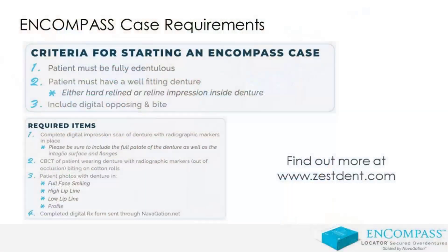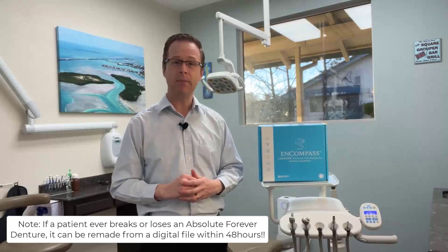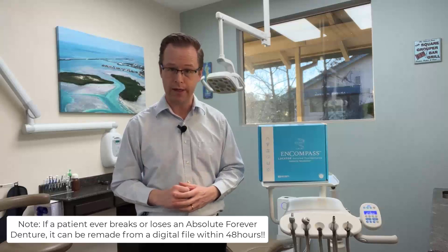Where I work up the patient with a little bit of impression, a cone beam scan, and send all this information off to the team at Navigation and Absolute to create a surgical and restorative plan that seamlessly come together, resulting in a patient here in the operatory where I can place dental implants with the help of a 3D printed template, and then use an Absolute Forever Denture, either at the time of surgery or at a later time, to take a denturist patient and turn them into an implant overdenture patient.